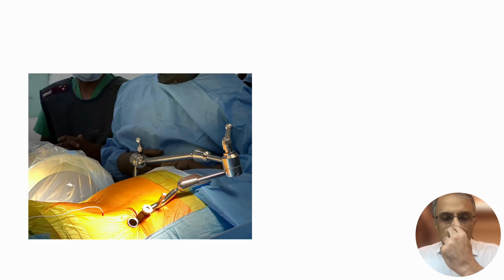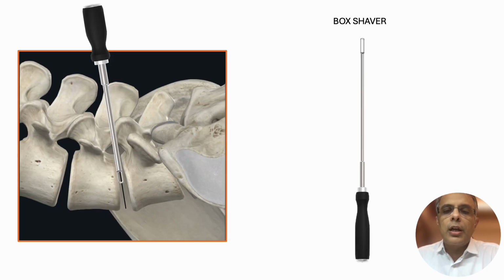This is how it looks. You can see there is a trigger electrode over here. This tube is docked, and the table mount arm will hold your tube in position, and the rest of the procedure you can do very easily from this.